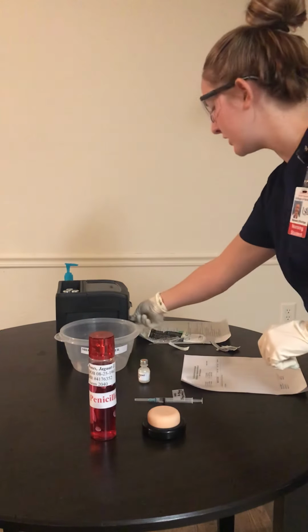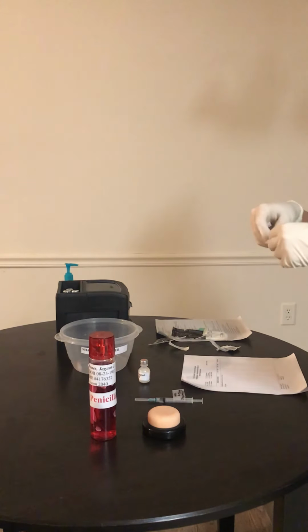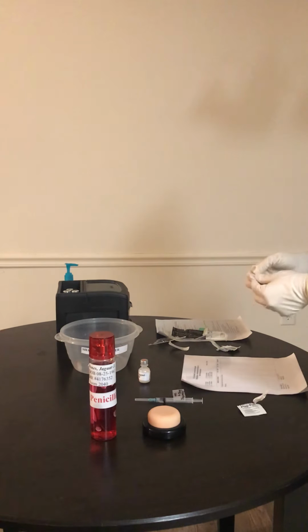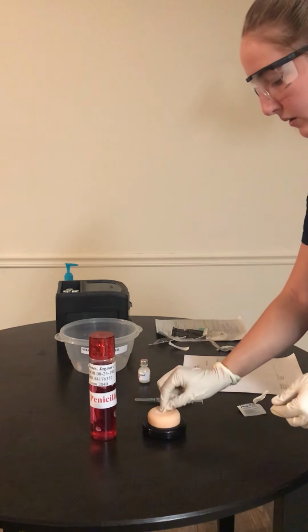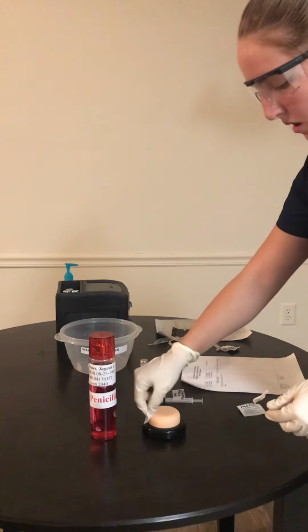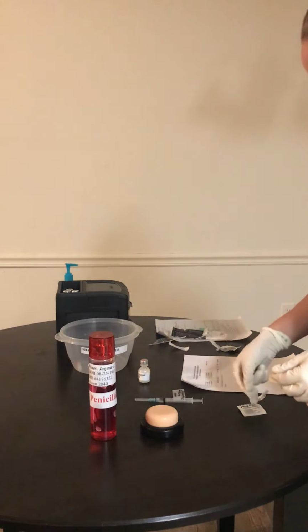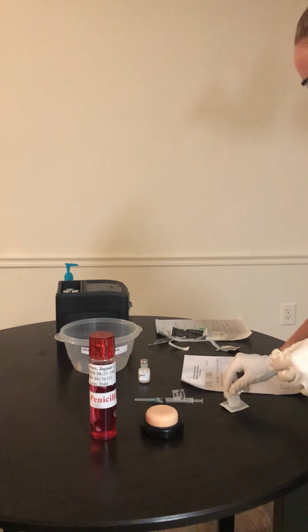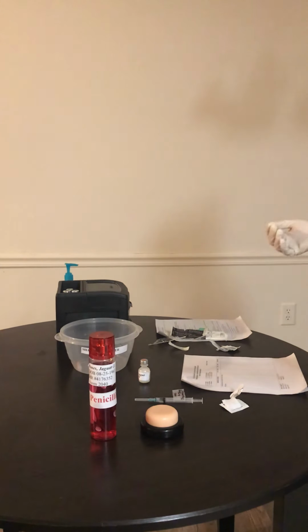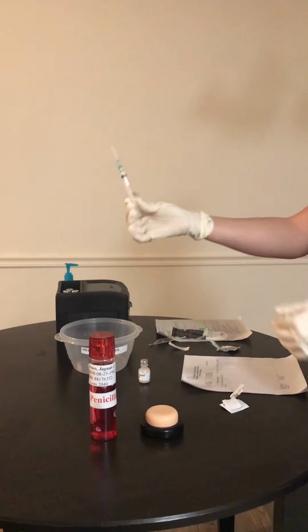Before I give the injection, I must clean the site with an alcohol pad, by going from the middle in circular motions all the way around. I will wait for it to dry, and I'm going to take my medication.